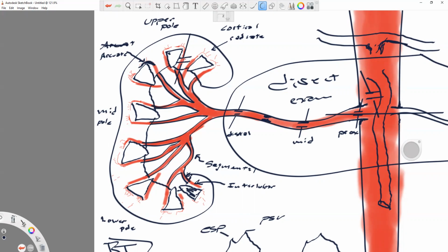So if I did one right here, and then maybe I'll do one right here. Oops, and then one right here. Wherever I see the color is going to help me decide where exactly these go. All right, obviously. And generally, if you hit those three areas, you're pretty well set.